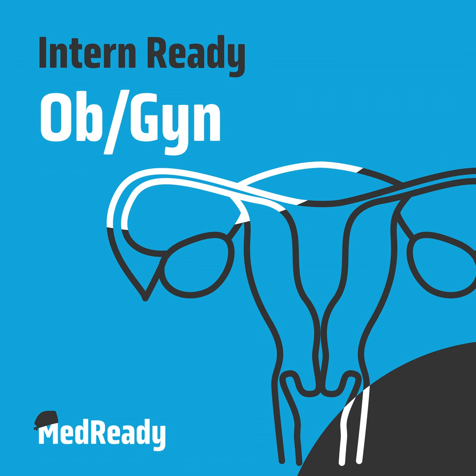So how are you talking to a patient in the pre-op area or in clinic prior to the procedure about what is going to happen? Yeah, so I tell patients that we'll be doing a hysteroscopy, which is using a thin instrument that's almost like a telescope to look through the vagina into the cervix and then into the uterus. It gives us a much better look into what's going on in their uterus.